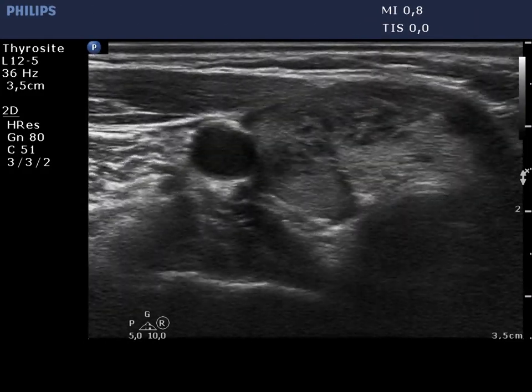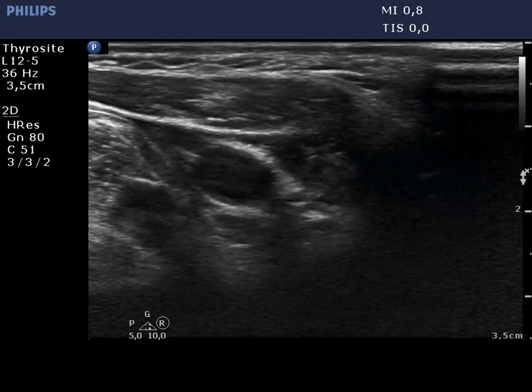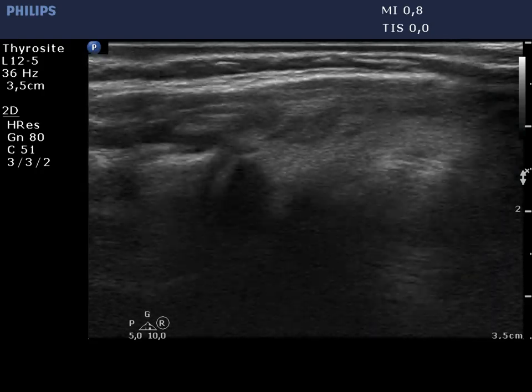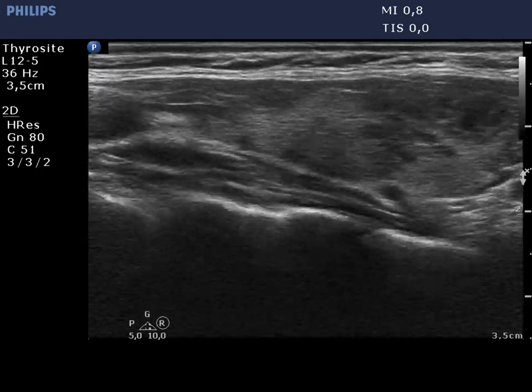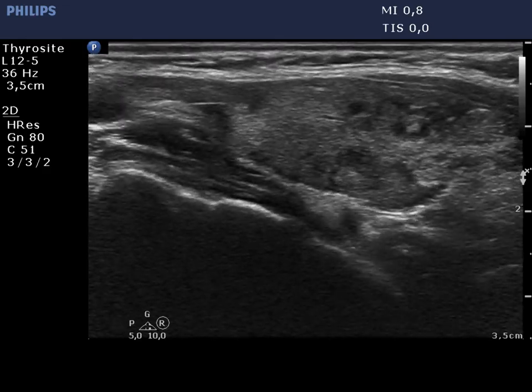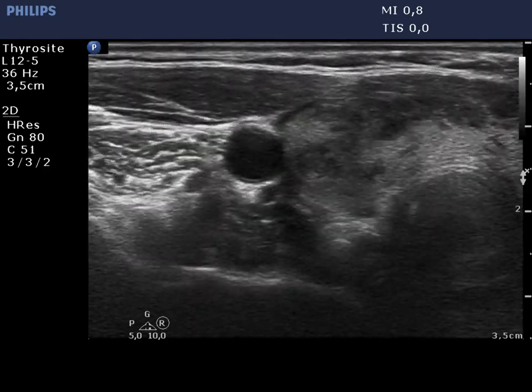The right lobe is isoechoic and has numerous discrete hypoechoic areas which have small, ragged isoechoic tissue parts. These lesions did not have a regular shape.